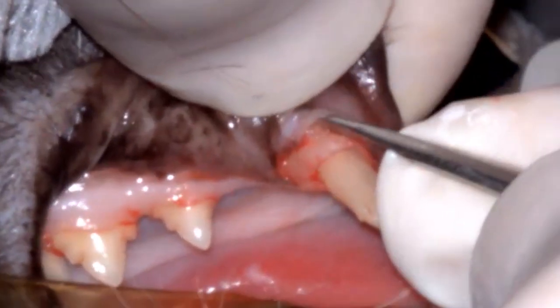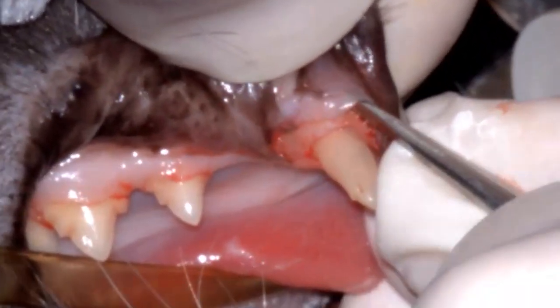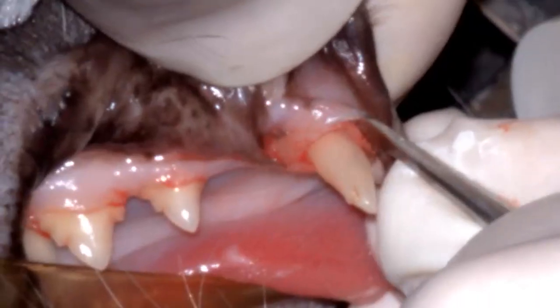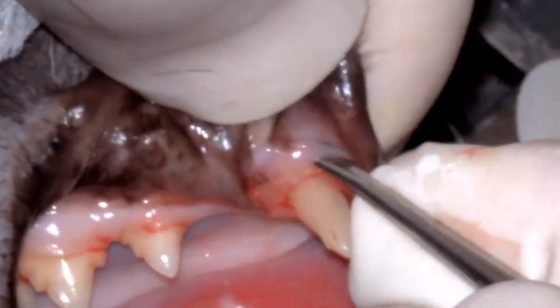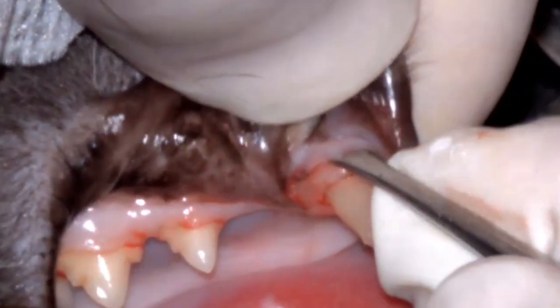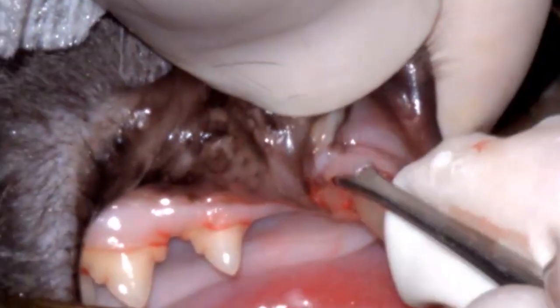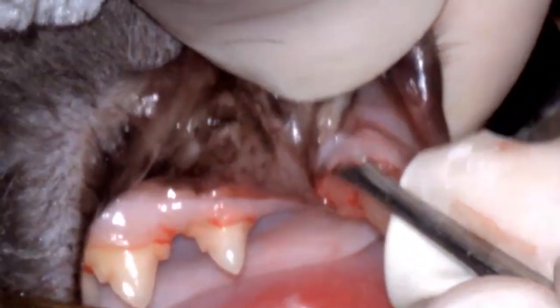It took me roughly 20 minutes to elevate the flap, remove the tooth, take my post-operative and intraoperative radiographs, and suture the wound closed.